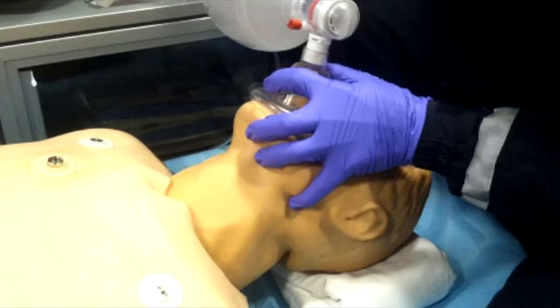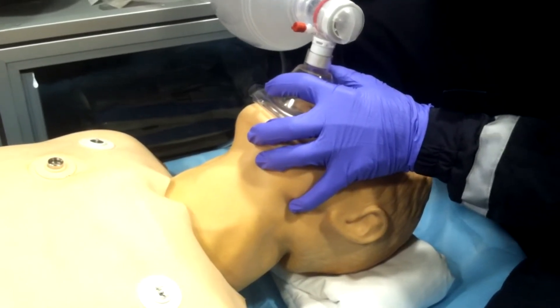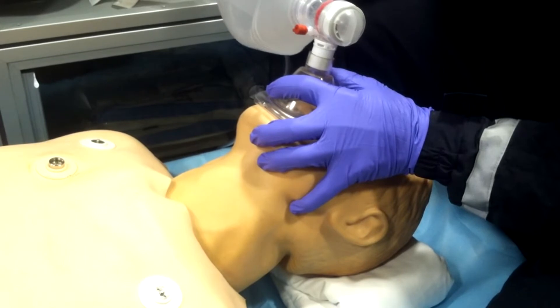He's bagging the patient nice and easy, but there's something else we can do. There is a good way to bag somebody, a better way, and a best way — and we're going to go over all of these. The first thing you have to understand is: does this patient have a gag reflex?